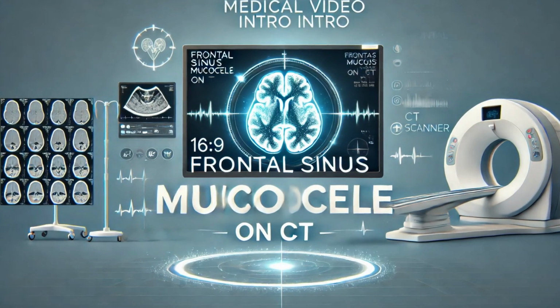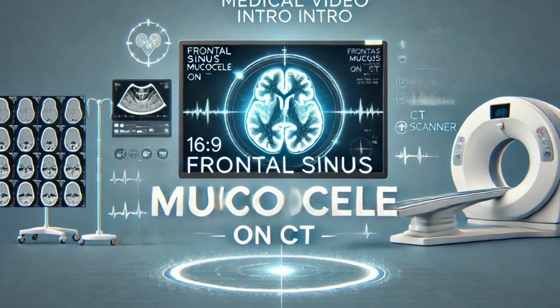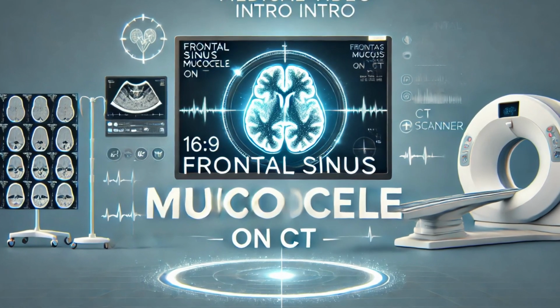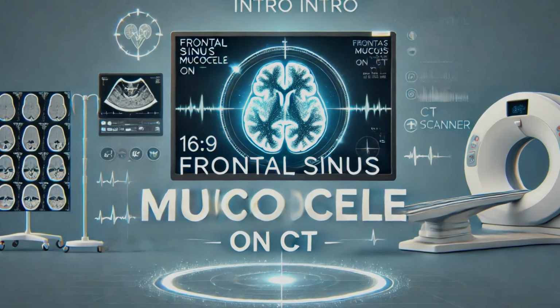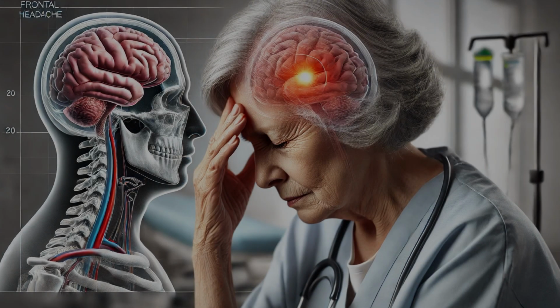This channel brings you clear and practical explanations of imaging findings in head and neck radiology. In today's video, we will review a classic case of a frontal sinus mucocele. We will go over the clinical background, the CT findings, and the most important points for diagnosis and management. Let's begin with the clinical scenario.